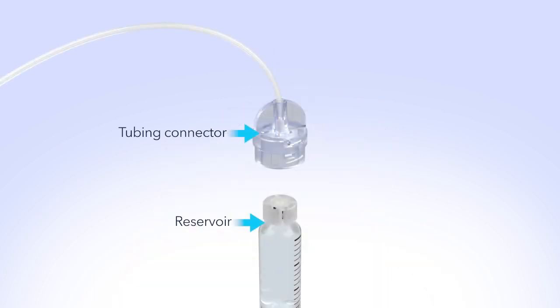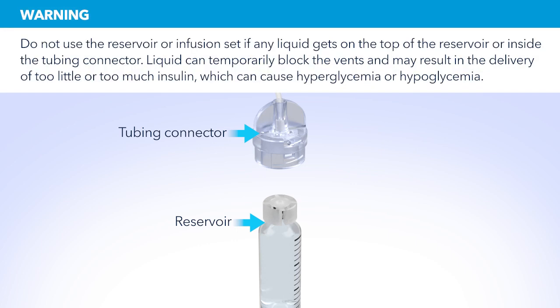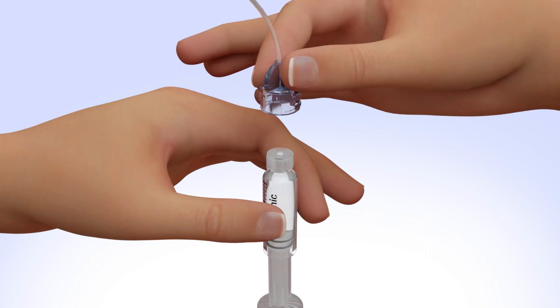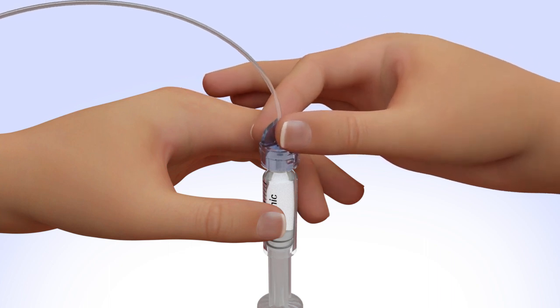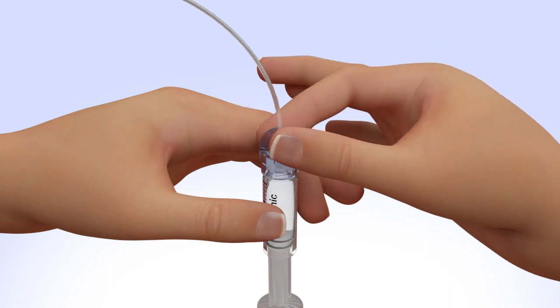Make sure both the top of the reservoir and the inside of the tubing connector are dry before connecting them. Liquid can temporarily block the vents on the tubing connector. If any liquid has gotten on the top of the reservoir or inside the connector, start over again with a new reservoir and set. Hold the tubing by the connector and place it on the top of the reservoir. Find the right position by turning and gently pushing the tubing connector until you feel it slide smoothly in place. Turn the tubing connector clockwise until the reservoir and tubing connector lock with a click.